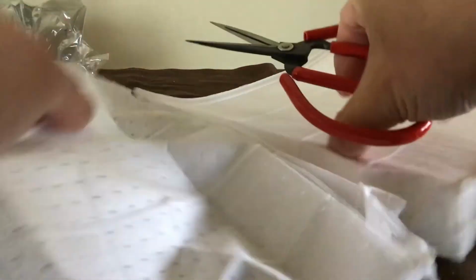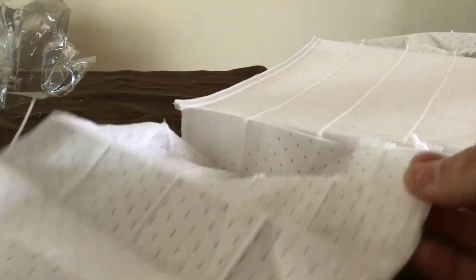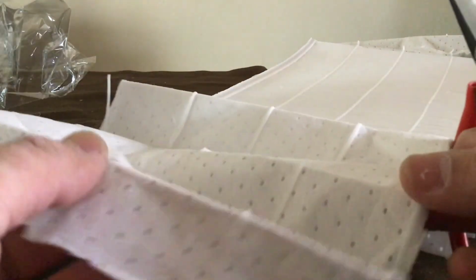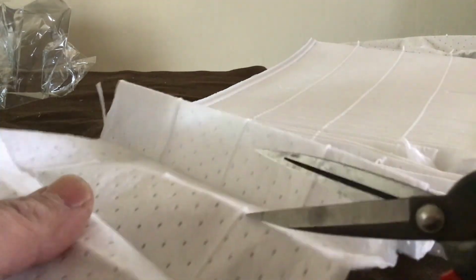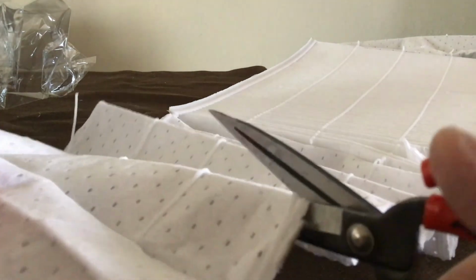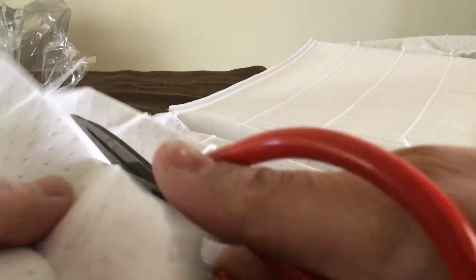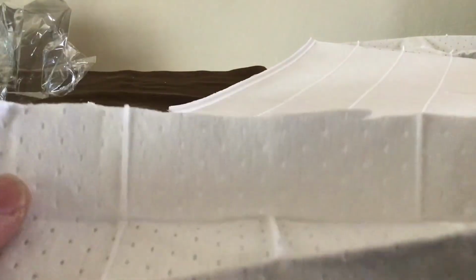So, anyway, we'll eventually take apart the entirety of the filters, but what we mainly need here is just a little bit of the filter to actually put into a mask, or into a respirator. Because of the size of the respirators that we're using, we only need 3 folds at a time. So I'll take these 3 and just cut along this fold that created that pleat. And then this piece is actually good enough to do several masks, probably about 3 or 4 of them.